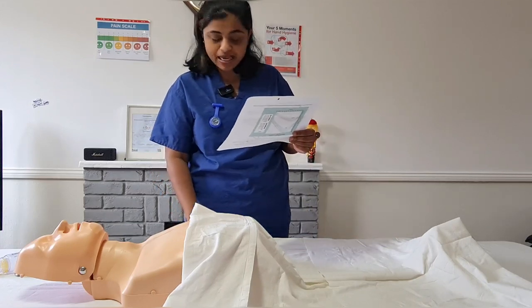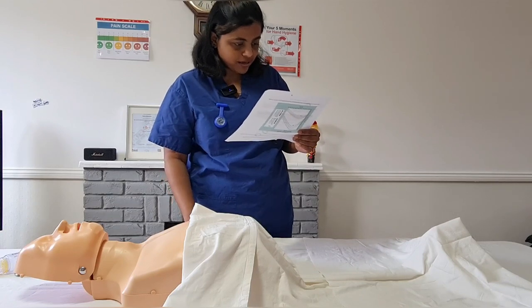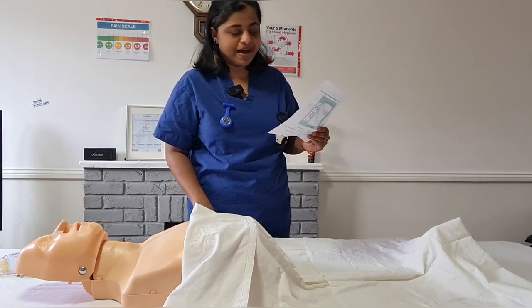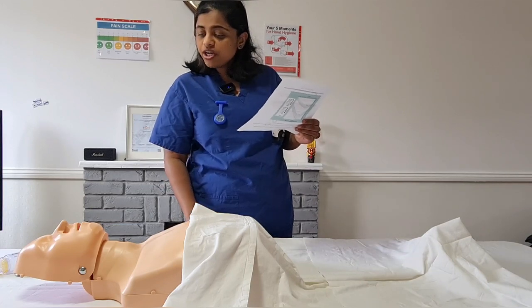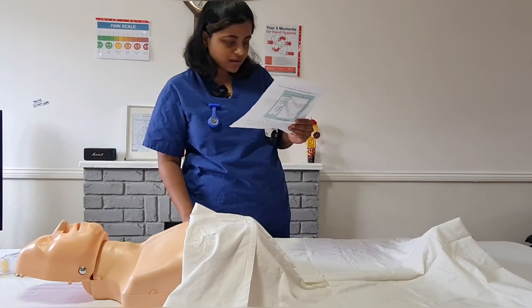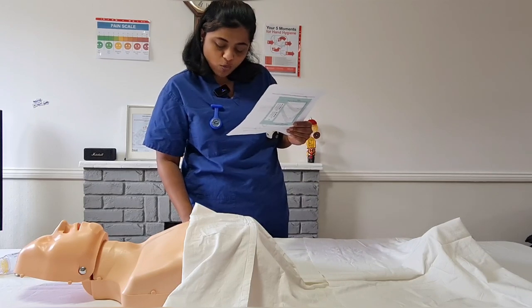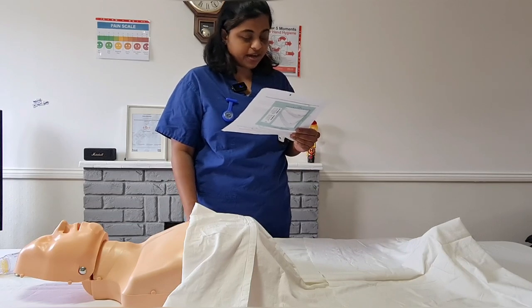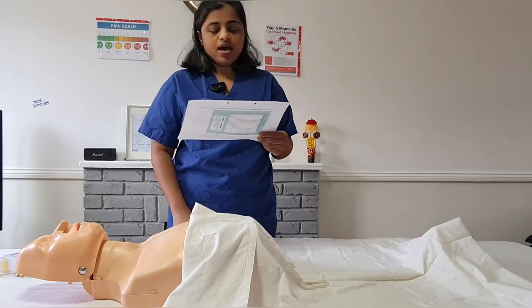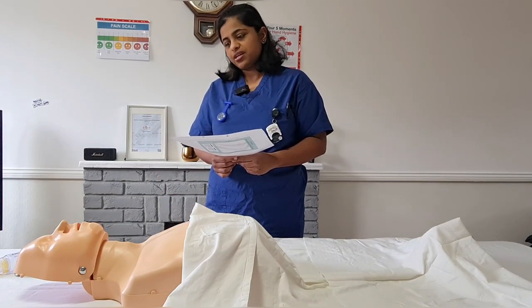Let me check your identity before I proceed. Can I confirm your full name please? Emma Hargraves. I am checking it verbally and with the patient's wristband. Can I check your date of birth please? 26/9/1963 — that is correct. Your hospital number is 12345. Can I confirm your address? 2 Long Street, Northampton. Are you allergic to anything? No. Good.